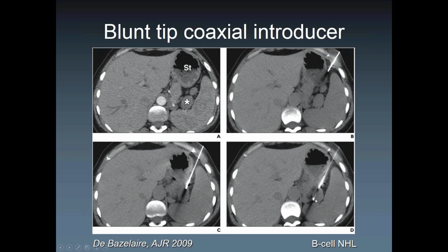You can also do that just by going through a bowel, and it's going to be gently pushed away. Keep in mind, though, this does not work if you have adhesions, right? Because there's no way that you can take advantage of the sliding nature of bowel because it's all stuck. So in this case, it's not going to help you much. So always keep everything in mind in terms of what the patient has been through already and what not.